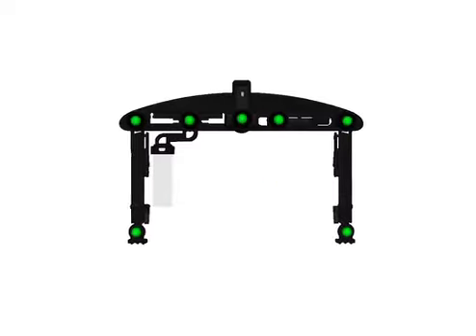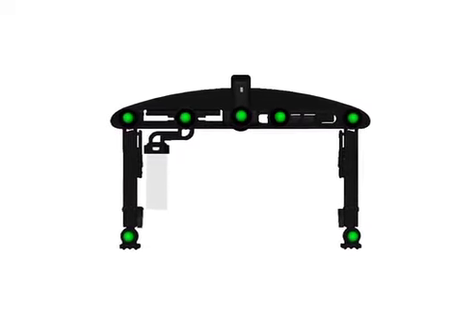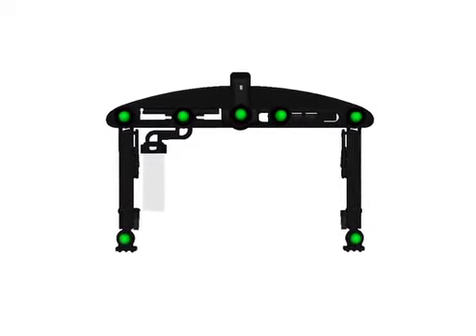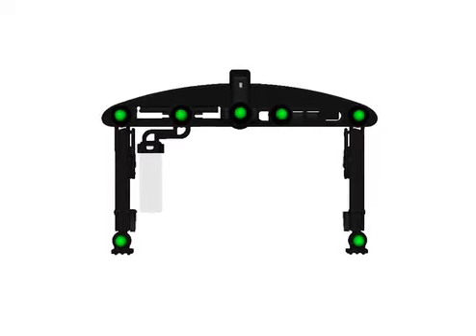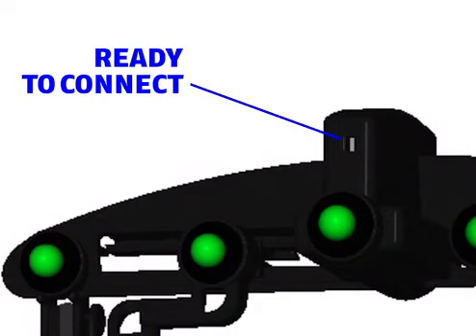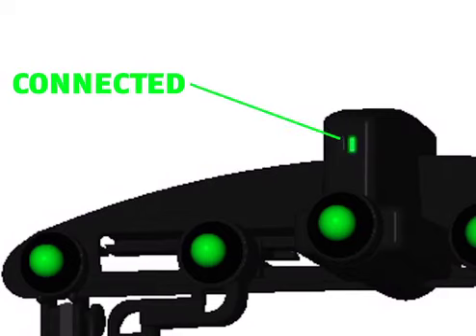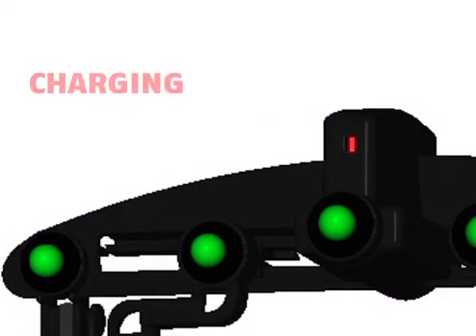The Optikam Posture Device is placed on the frame when taking a measurement picture and allows the app to obtain all eyewear measurements with one single picture. The OPD is turned on with motion. The OPD light indicator will blink blue when turned on, will blink green 4 times when connected, and will blink red when charging.